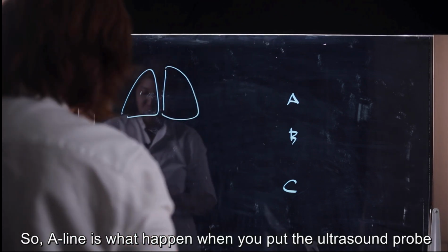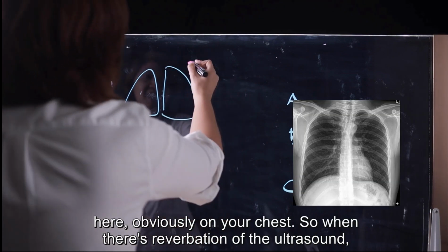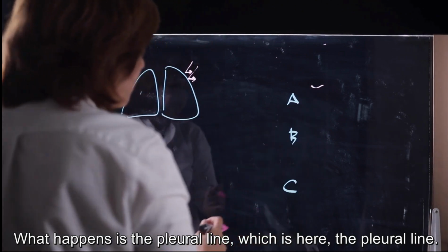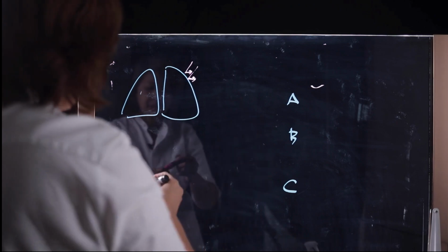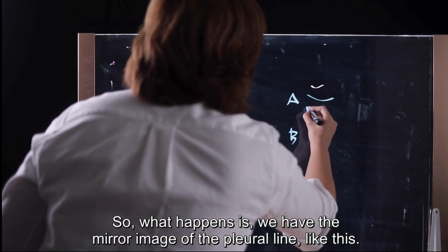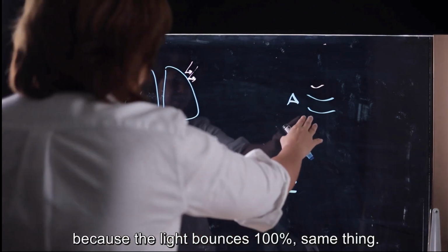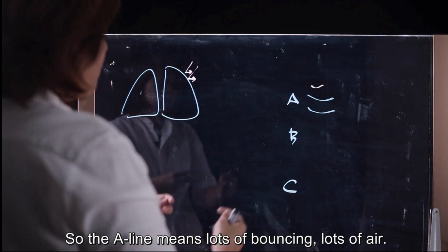So A line is what happens when you put the ultrasound probe on your chest. When there is reverberation of ultrasound, the pleural line, which is here, will get mirrored because the sound bounces back 100% since you have a lot of air. So you would have a mirror image of the pleural line like this. It's like I'm standing at the mirror and I see myself because the light bounces 100%. It's the same thing. So A line means there's a lot of bouncing, there's a lot of air.